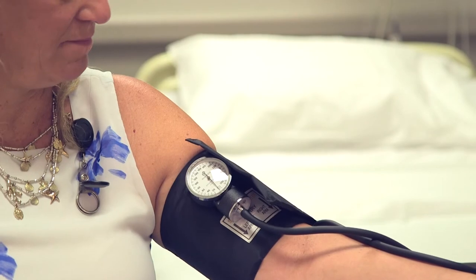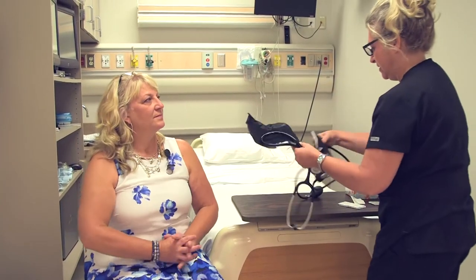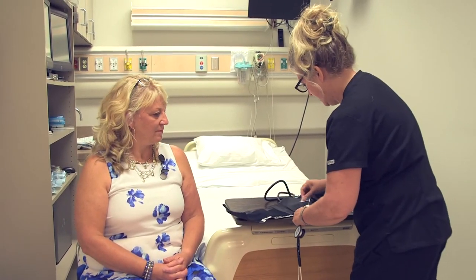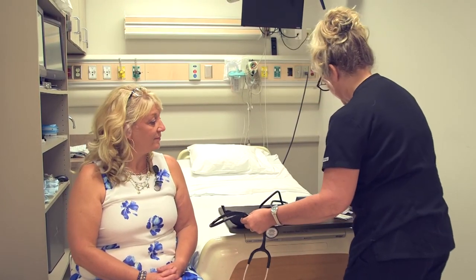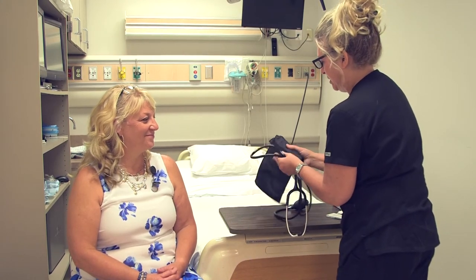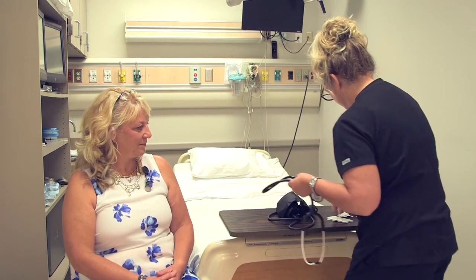Okay, all right. Blood pressure is okay. I do like to see it more around 120 over 80, but sometimes there are a lot of factors that can play into that blood pressure reading. All right, so we've got that completed.